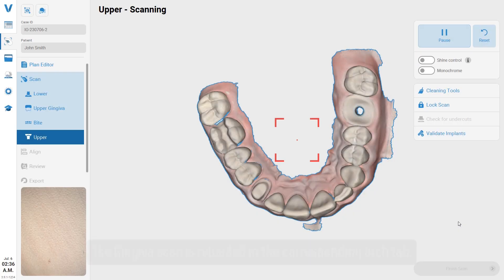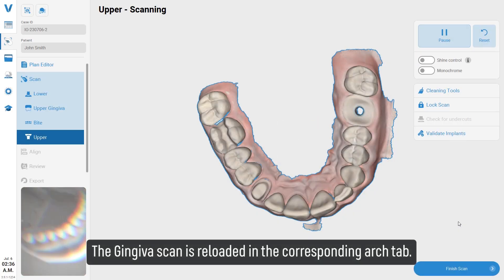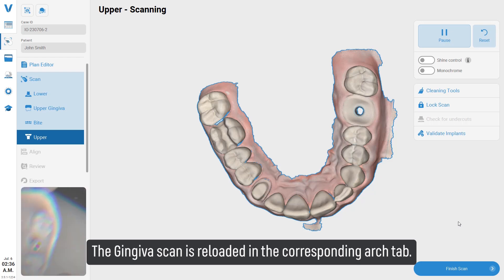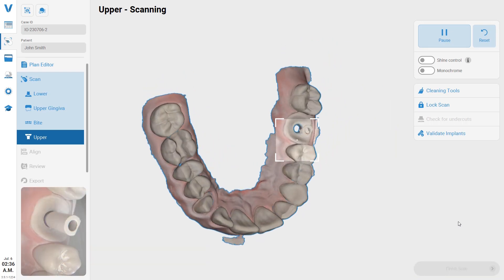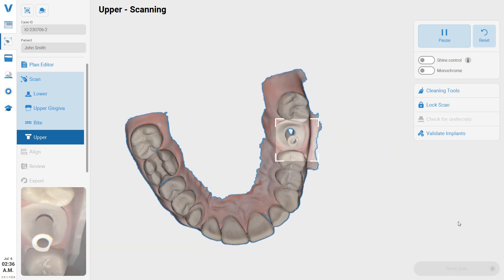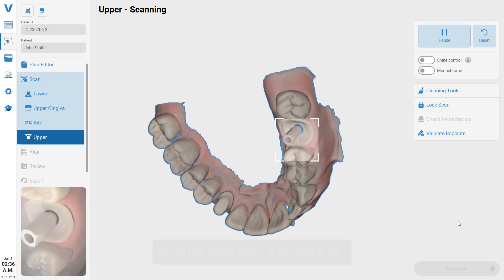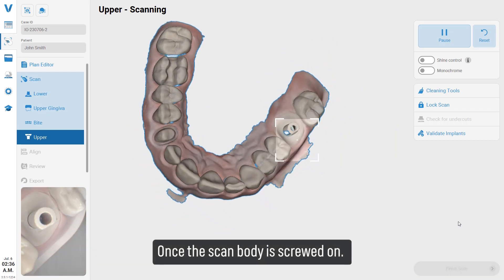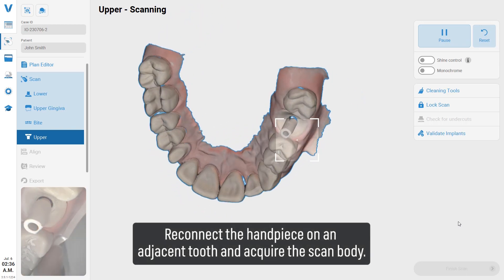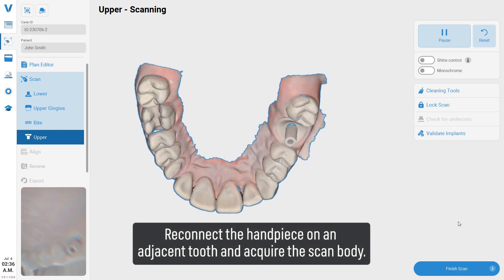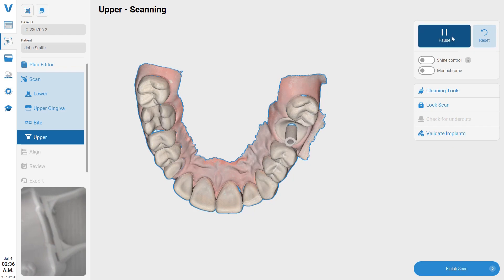The gingiva scan is reloaded in the corresponding arch tab. Once the scan body is screwed on, reconnect the handpiece on an adjacent tooth and acquire the scan body.